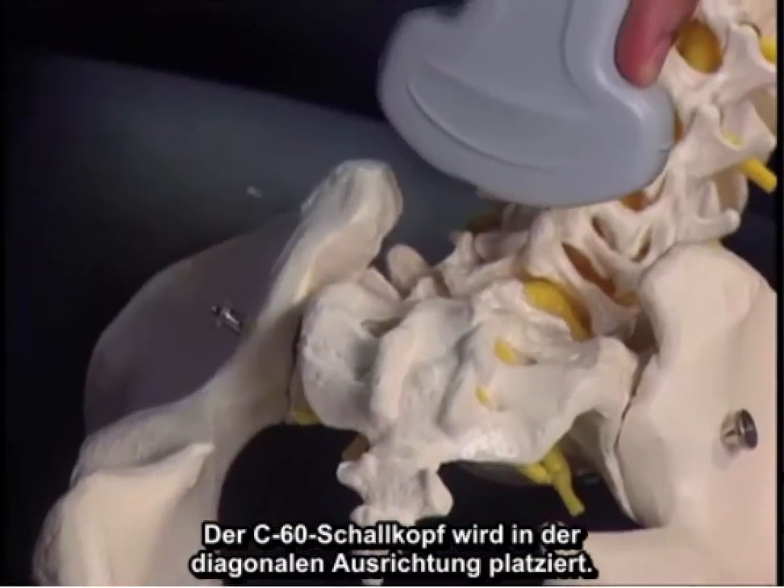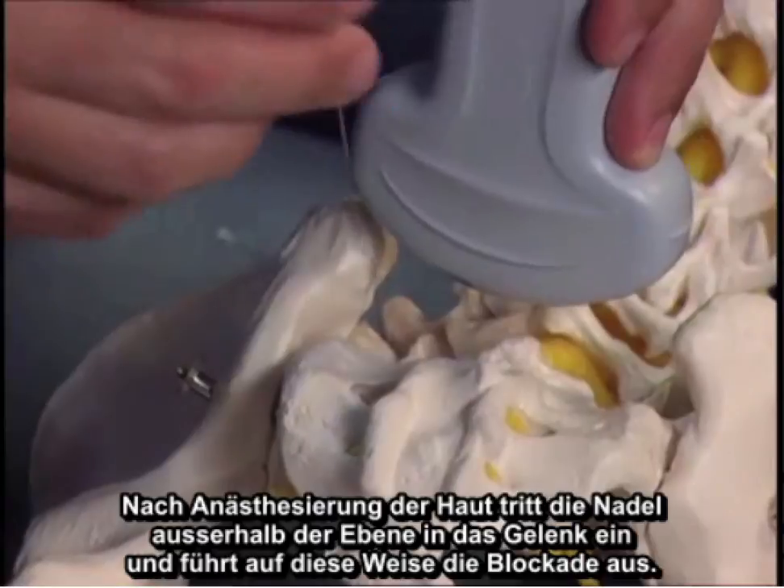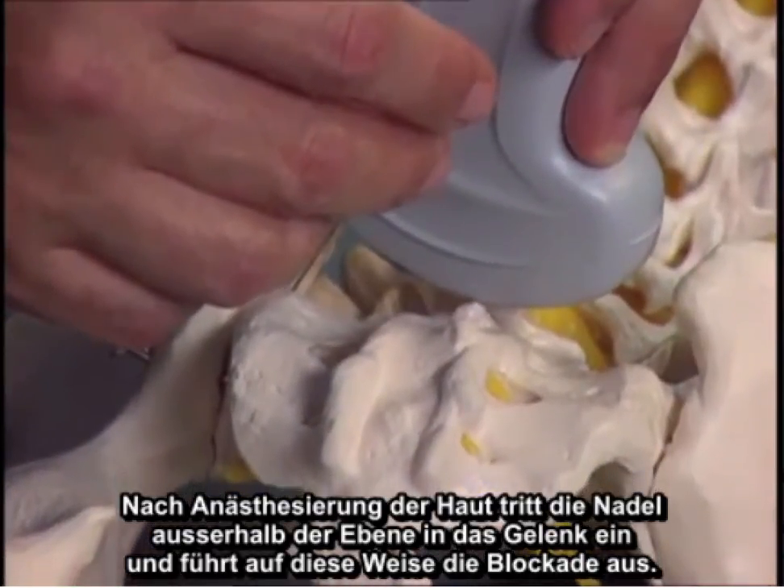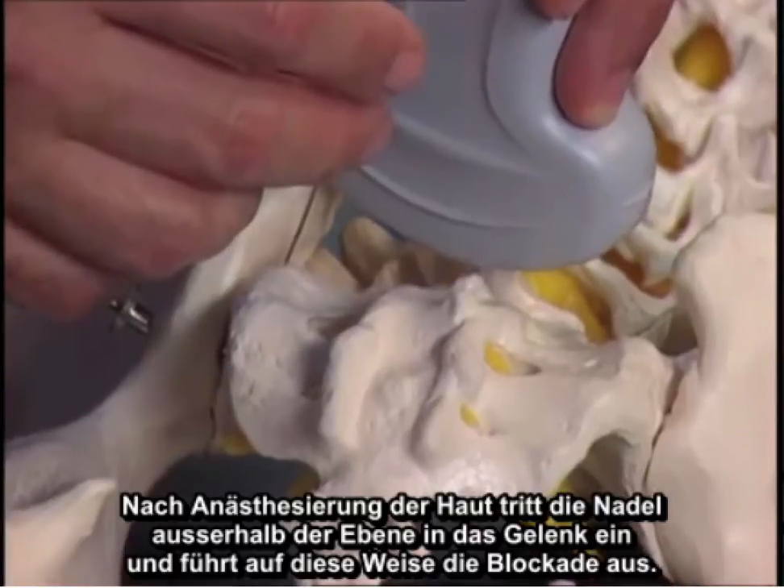The C60 probe is placed in the transverse orientation. After anesthetizing the skin, the needle enters out of plane into the joint, thus performing the block.